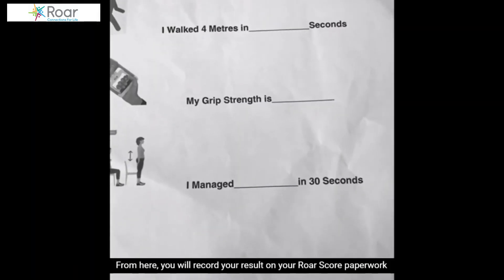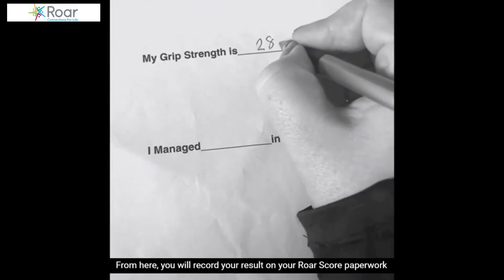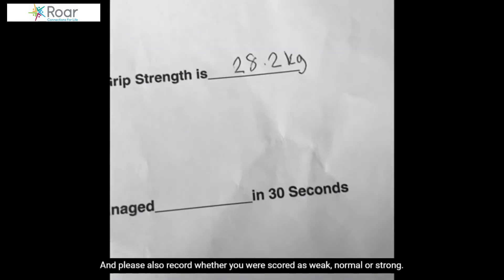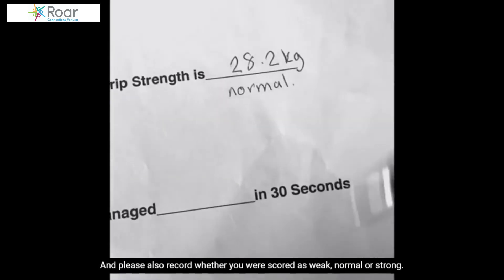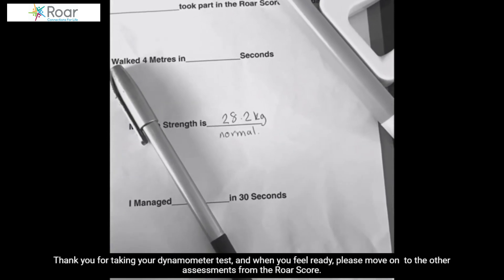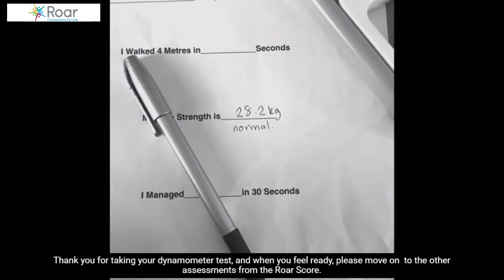From here, you will record your result on your RoarScore paperwork. Please also record whether you were scored as weak, normal, or strong. Thank you for taking your dynamometer test and when you feel ready, please move on to the other assessments from the RoarScore.